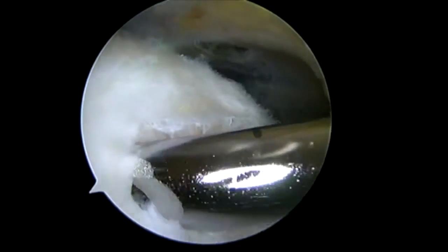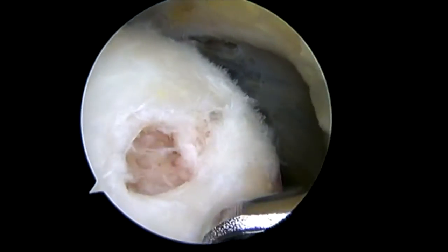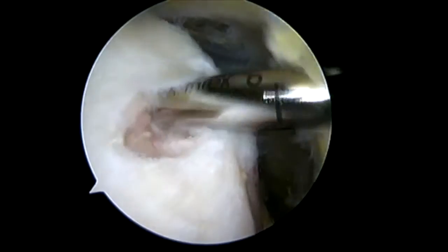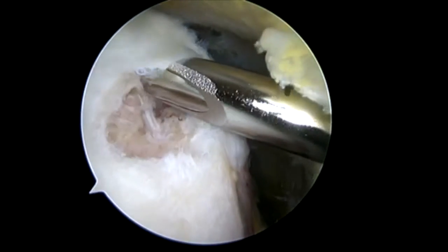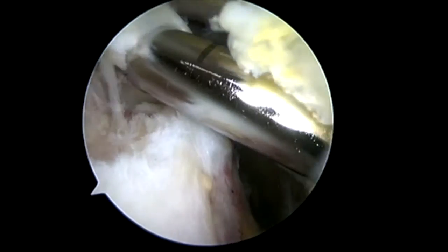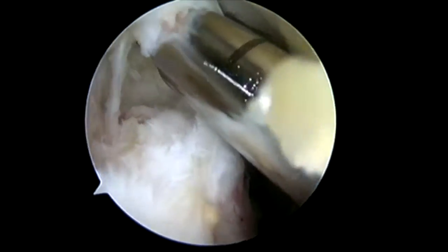So we're going to repair this tear with an anchor as well as augment this with our rotation patch. If the tear was not of such a great size, then I would be repairing this tendon with the rotation patch primarily. Here as we elevate, you can see this tear covers a far greater percentage of the supraspinatus footprint. So we're going to take the supraspinatus down to a good bleeding bony bed.